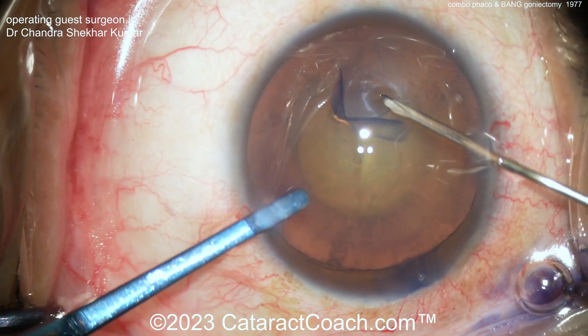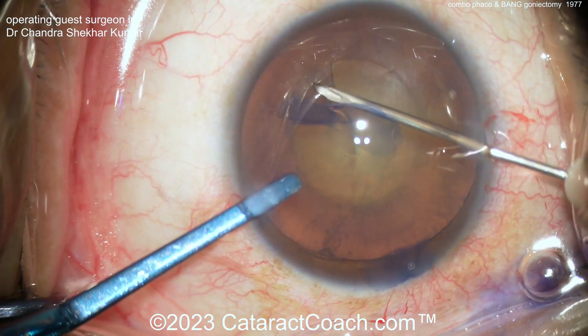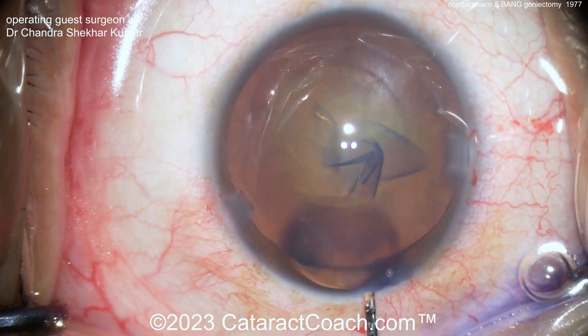Now you can see a nice rhexis being done here. It's important to have a rhexis that's going to overlap that optic 360° in order to hold it securely in position.